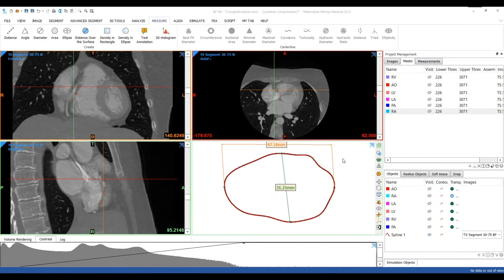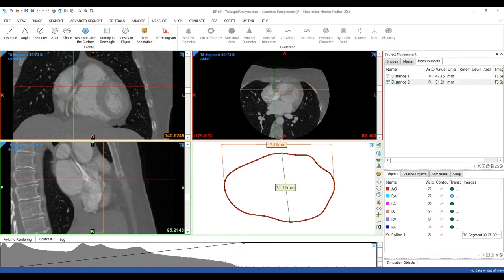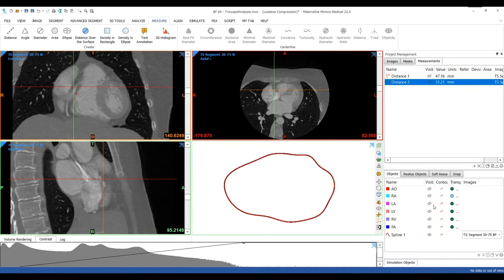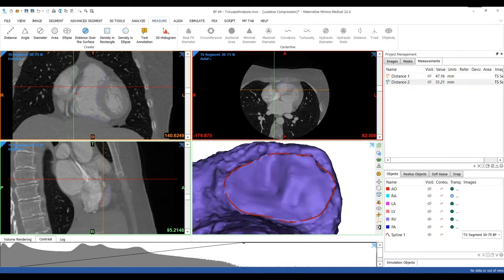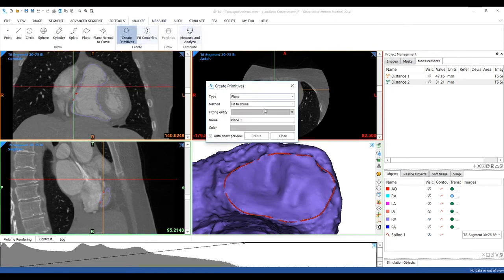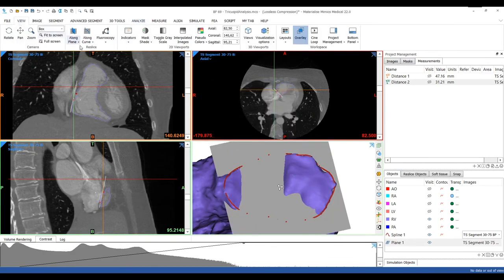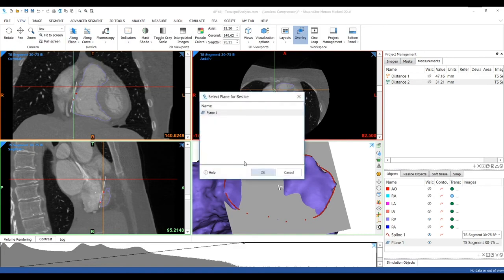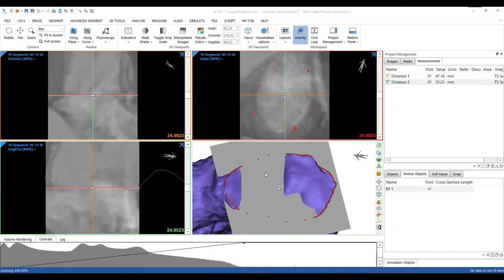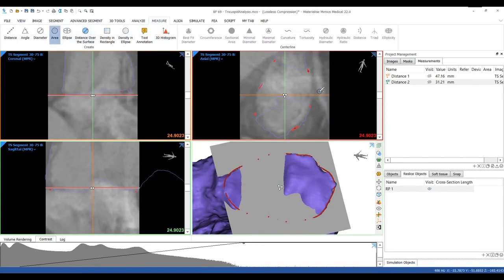We will now look at another option to analyze the tricuspid annulus. So let's hide the previous measurements and show the right ventricle. Then we will create a best fit plane to this spline and re-slice the images along this plane. Then we will go to the Measure menu to create an area measurement.